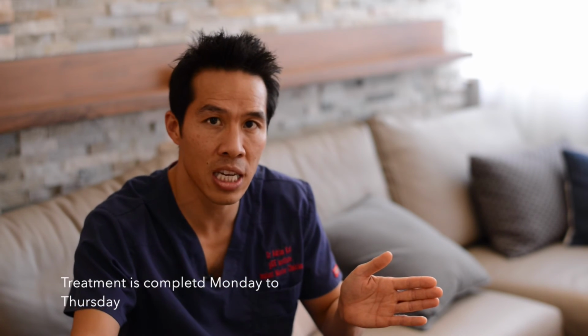So between Monday and Thursday, the patient will actually go from having surgery to having a complete set of teeth by Thursday. The reason why we have so many steps is to make sure that the patient's final result is exactly what they expect when the final all-on-4 bridge goes in.